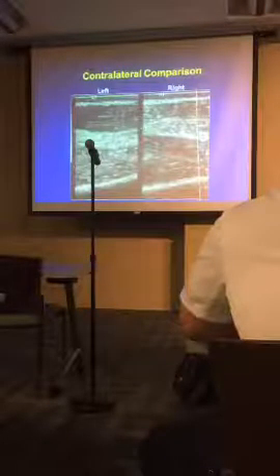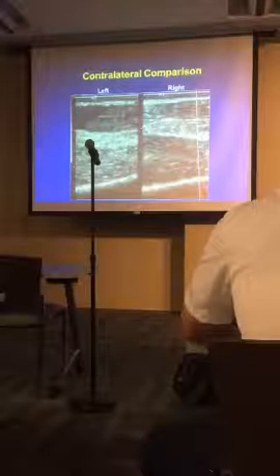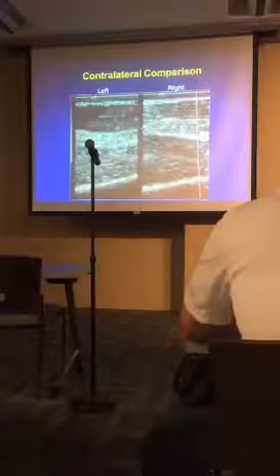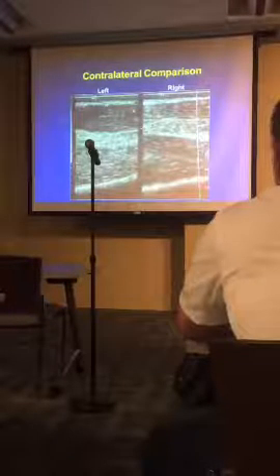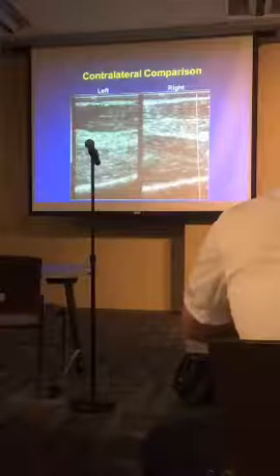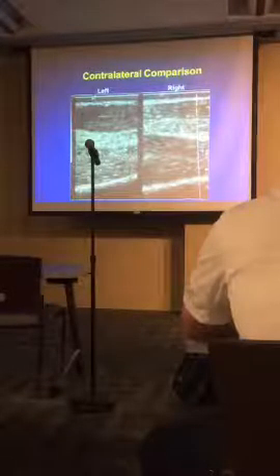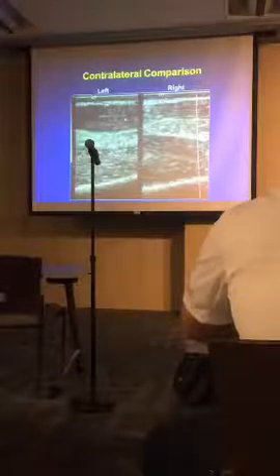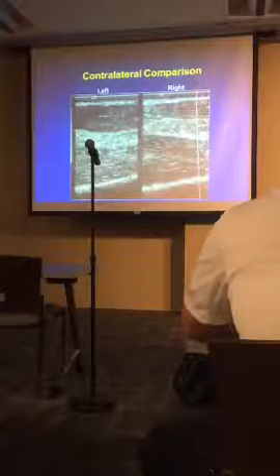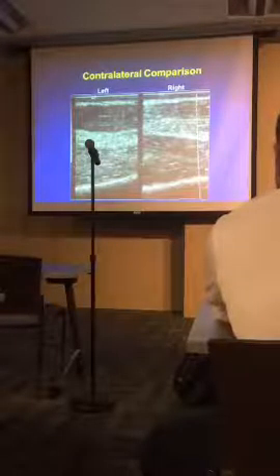Here's a simple example of contralateral comparison: the painful Achilles tendon on one side compared to the other. You can see the tendon is thicker, more hypoechoic, and has more through-transmission on the affected side. This is classic Achilles tendinosis compared to the normal contralateral side. We use bilateral comparison less as experience grows, but it remains a daily tool.